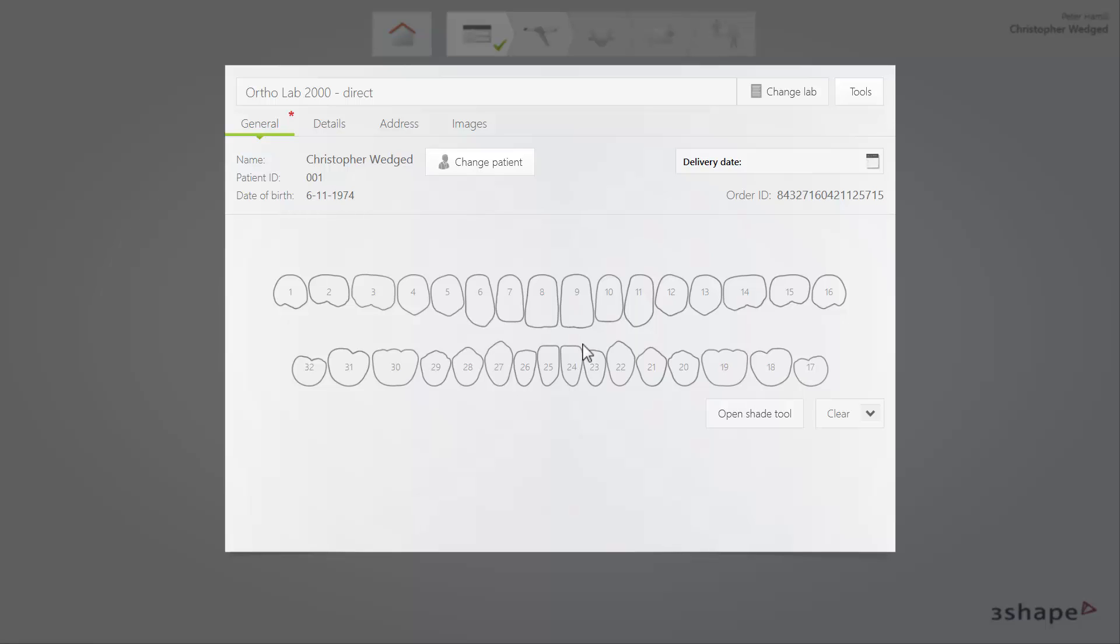Also, while on the Order Form page, you can change labs. To do that, click the Change Lab button.